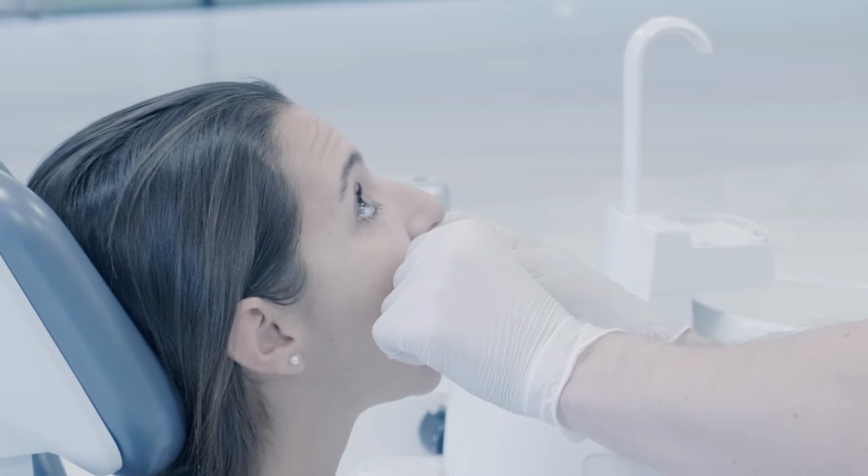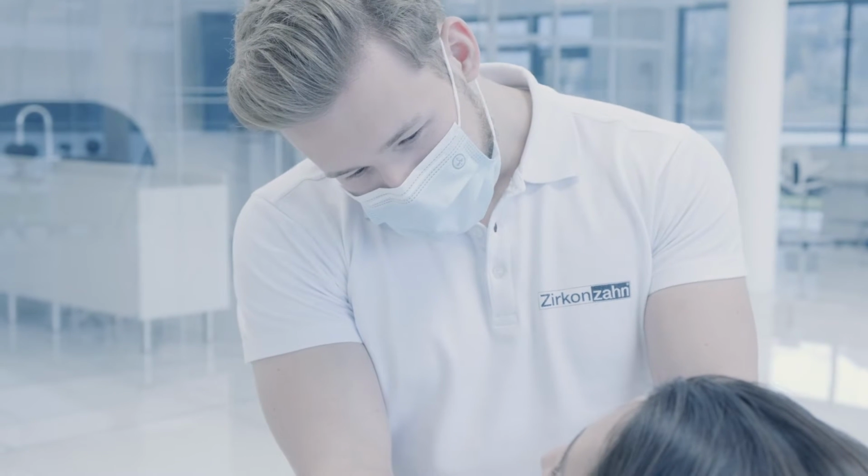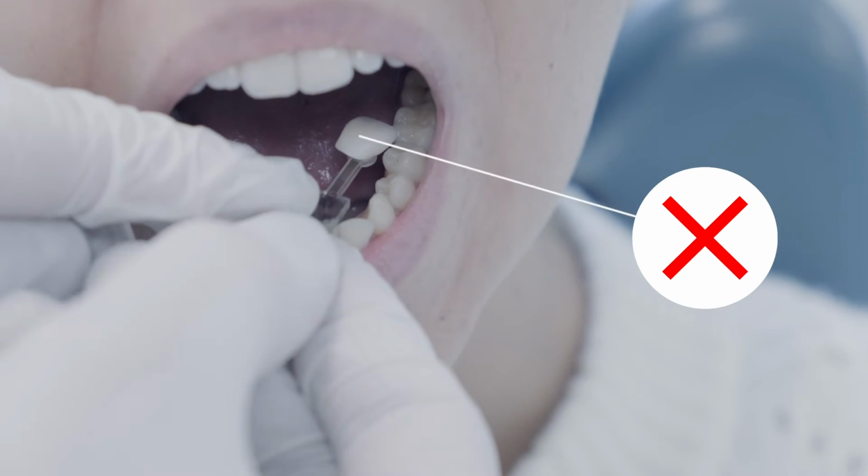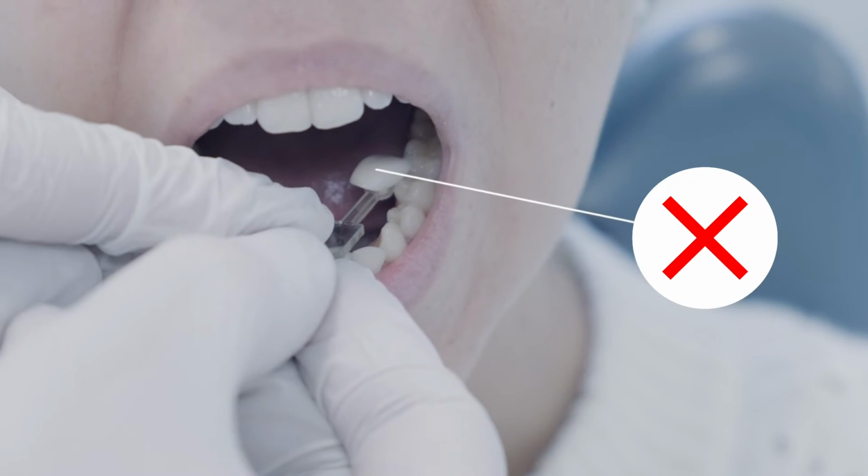The teeth surface must not be dried out, or they will appear too white. Carry out color determination quickly and no longer than 5 to 7 seconds. The human eye tires quickly when looking at something with concentration. This also affects the color perception. Color theory shows that shape and surface structure considerably influence the color effect.